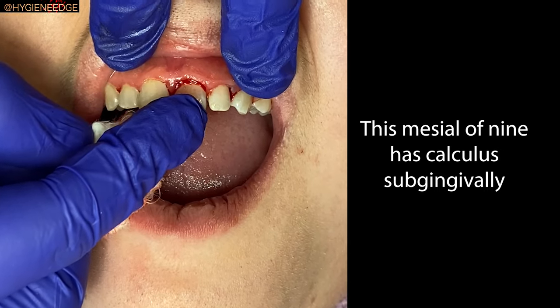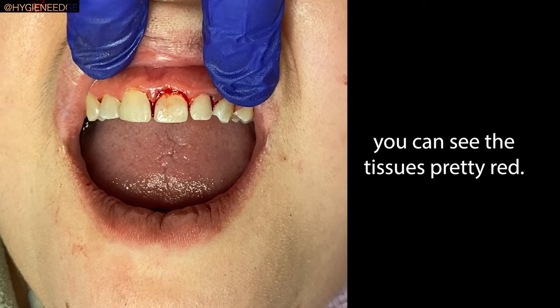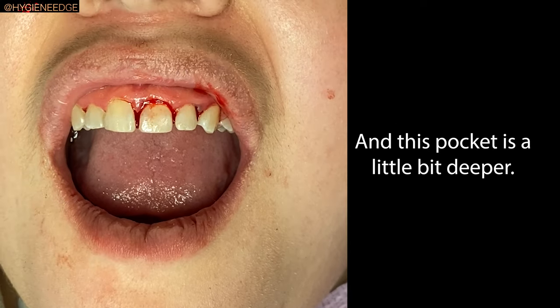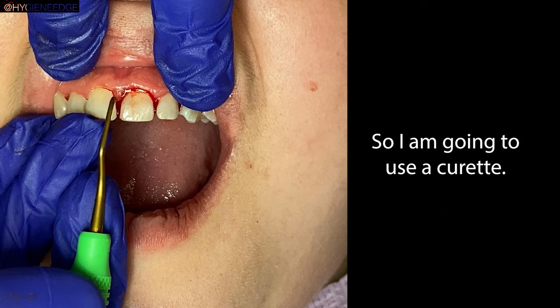The mesial of tooth nine has calculus subgingivally. You can see the tissue is pretty red. You can use a gracey or a curette to remove this calculus. This pocket is a little bit deeper, so I'm going to use a gracey curette.